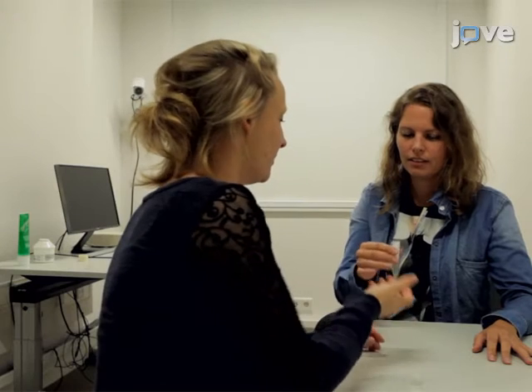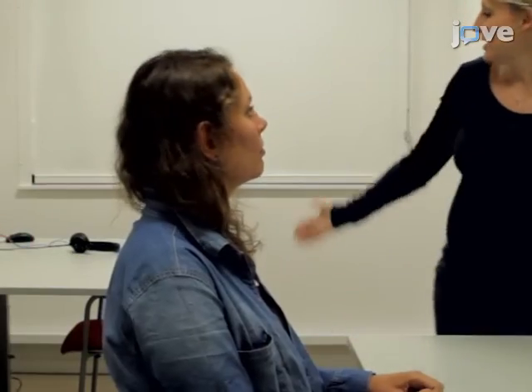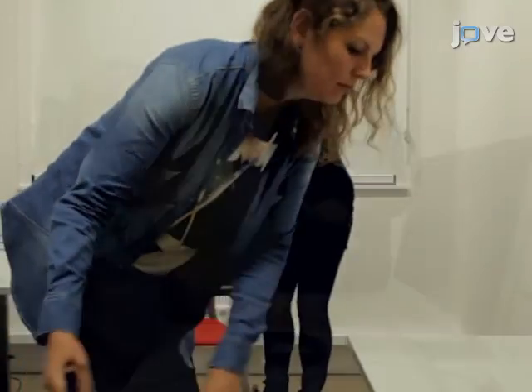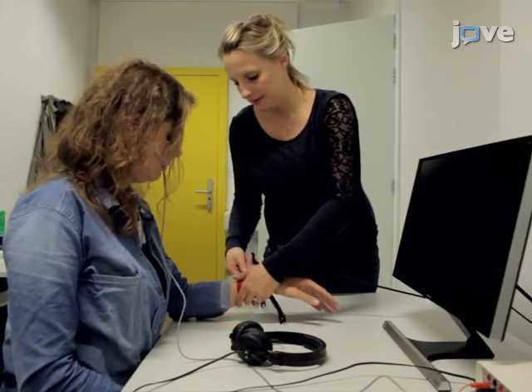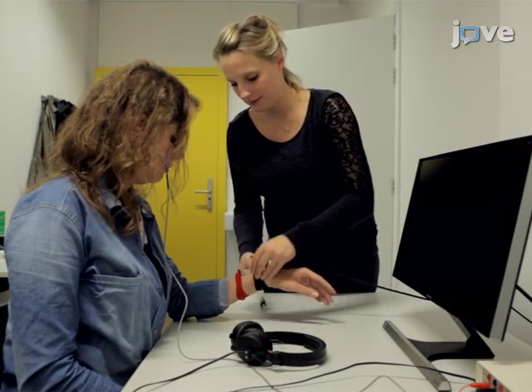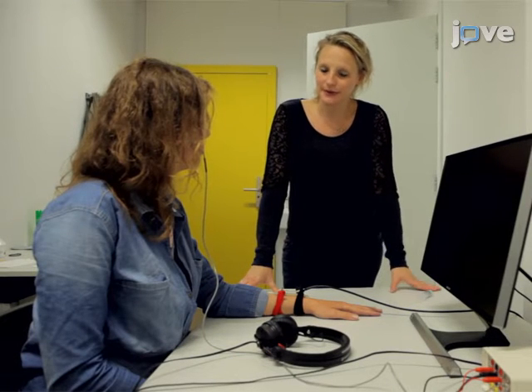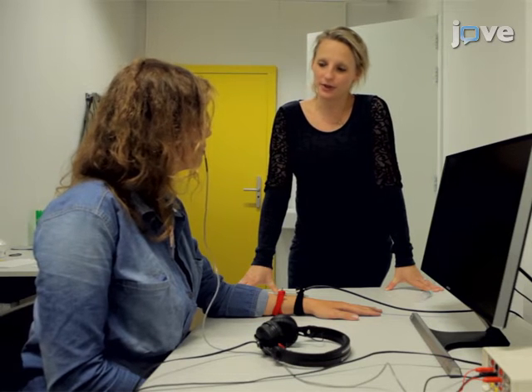On the second day of testing, obtain blood pressure and heart rate measurements as well as salivary samples. Position the participant in front of the computer screen and attach the EMG and shock electrodes as shown earlier. Inform the participant that the shock level will remain the same. Instruct the participant that the same two pictures will be presented on the computer screen and ask them to remember what they had learned the previous day.